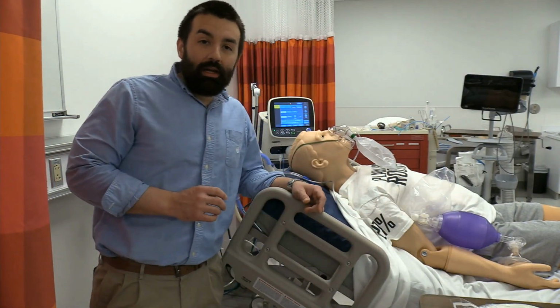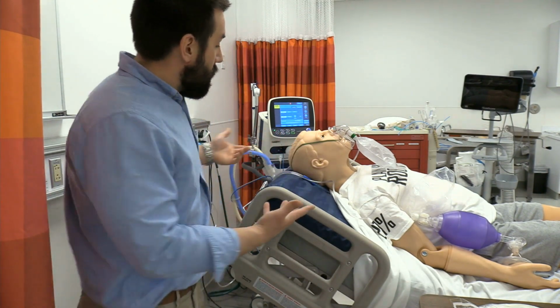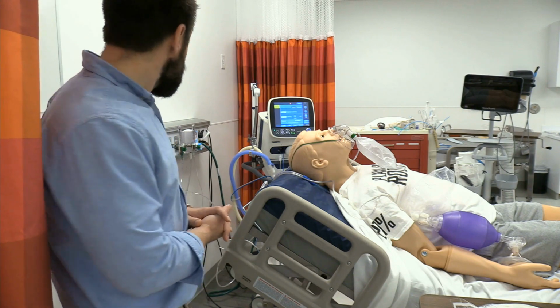What's going on, everybody? You're going to do a little video about assisting intubation here today. All right, so a couple of things here before I get into the equipment and we proceed with the actual process of tubing this patient.